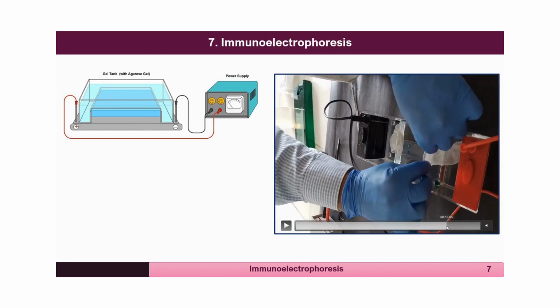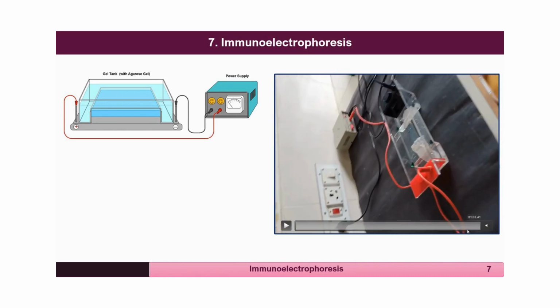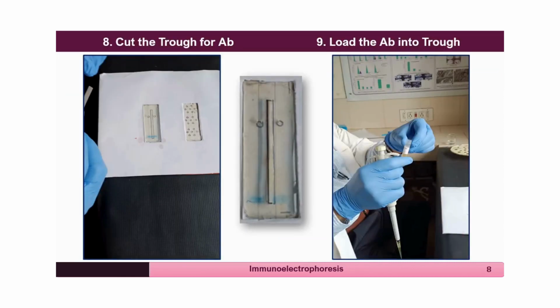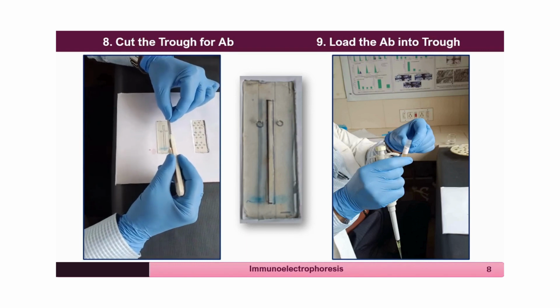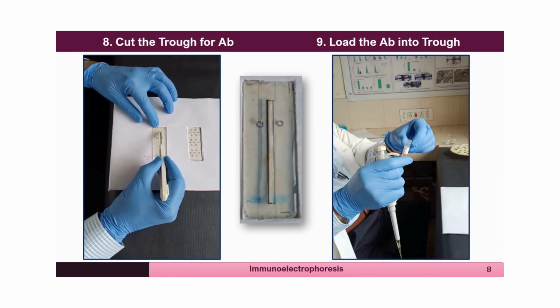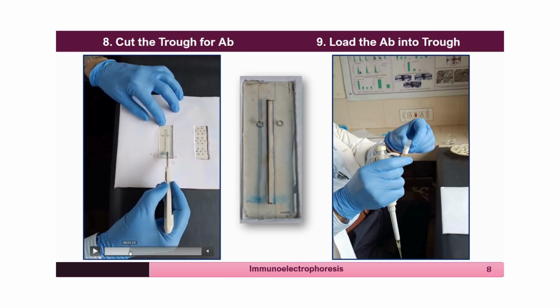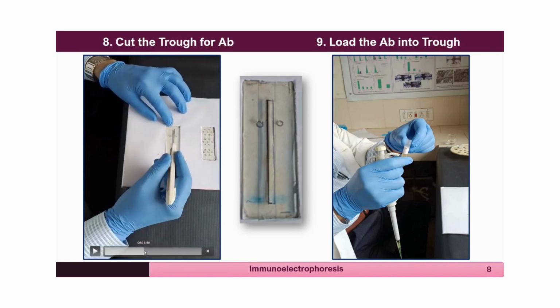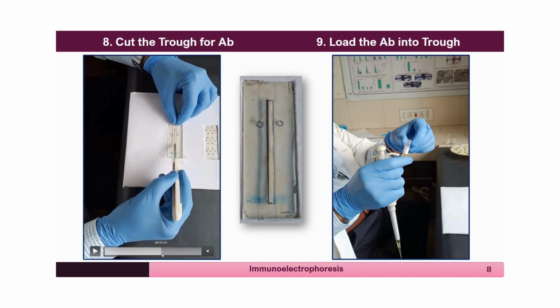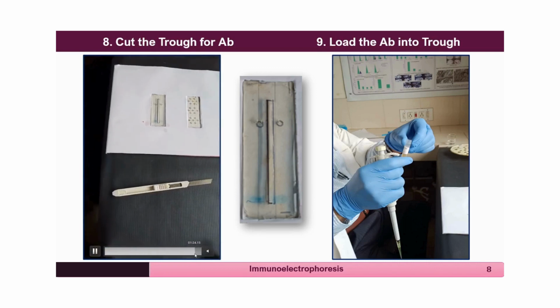Both the sides are connected with the gauze piece dipped in the buffer, and the electrophoresis is run until the tracking dye comes to the other end, as seen in this figure. Once the tracking dye has come to that point, take the slide, put it on a stencil and, using a sharp blade, cut the trough in the middle as indicated in the stencil. After cutting the agarose with a sharp blade, lift the agarose and create the trough.